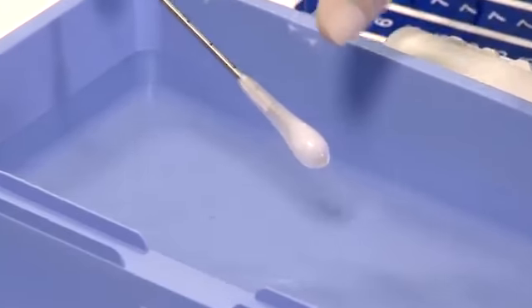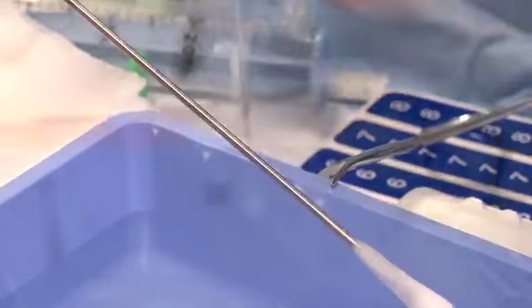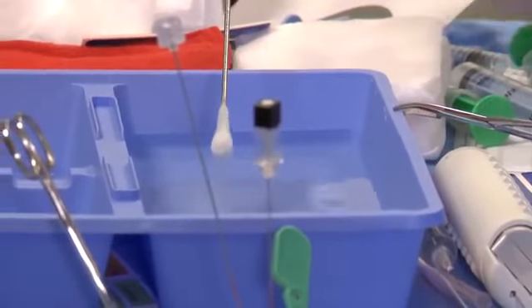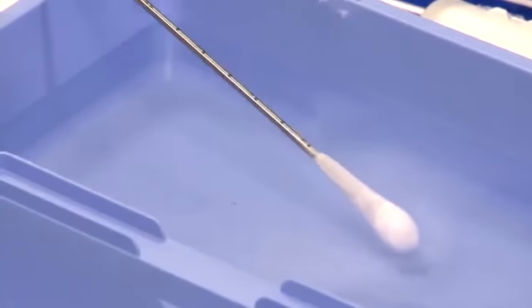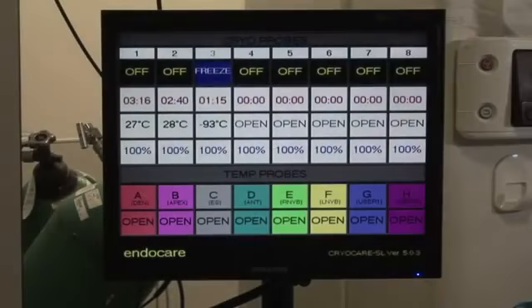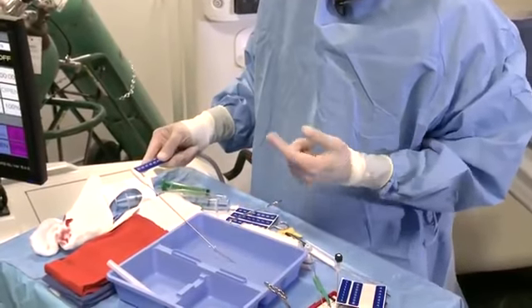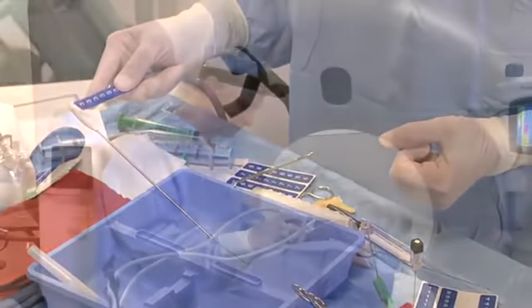That's another safety feature. This ice ball is kind of small because this is a long probe. The smaller probes, the shorter probes, and the probes with lesser diameter are very efficient. They get big and cold quickly. So let's go to thaw. So even though the ice ball is gone, we're going to continue to run the helium cycle, because if you don't, you take it out, it'll just freeze again.